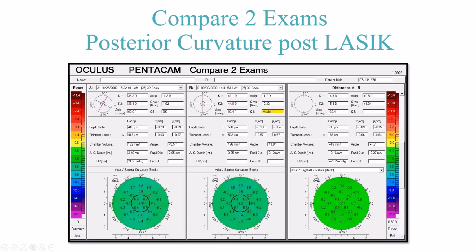If you look at the back surface, however, you'll notice on curvature there's very little change, because you don't expect to see change on the back surface of the cornea. In addition, if you're looking at curvature, don't forget the curvature of the posterior cornea is a low power minus lens. So even a change that you'll be able to pick up on the anterior surface in curvature can be masked on the posterior cornea because it's a much lower power. Again, we're not dealing with an air-corneal interface. We're looking at index of refraction that's similar between the cornea and the aqueous.